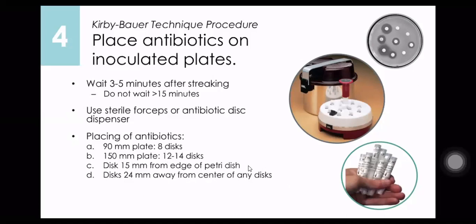Okay, so how do you measure the 15 mm and the 24 mm? So we are using this blue method, okay? So did you get the blue method, guys? Yes, ma'am. Okay, the blue method.